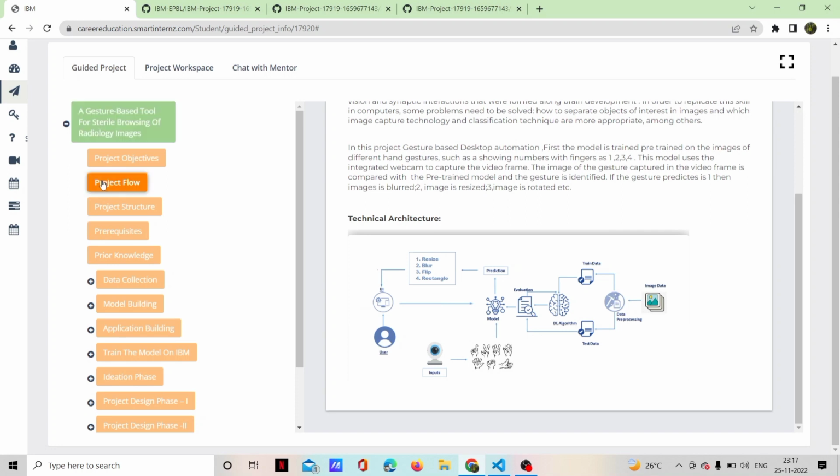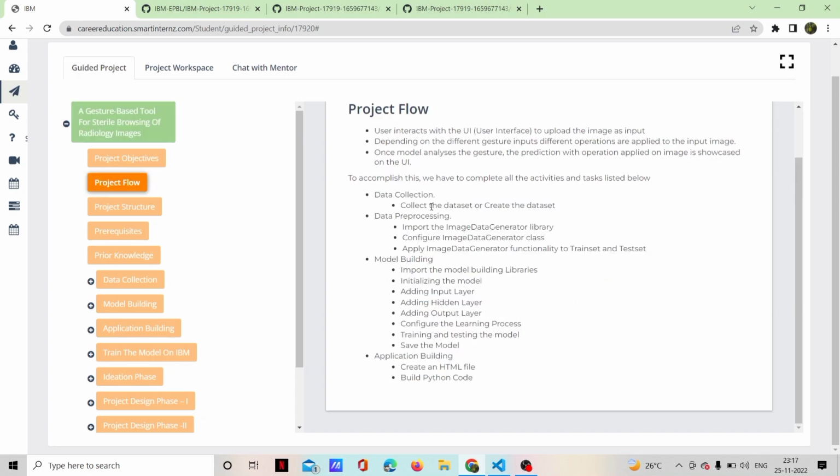We have downloaded the dataset and used a convolutional neural network for analyzing the visual images, which is a part of the DL algorithm, which is nothing but the deep learning algorithm. We have imported Flask, which is a popular Python web framework, which is a third-party Python library. We have trained and tested the model using the deep learning algorithm.